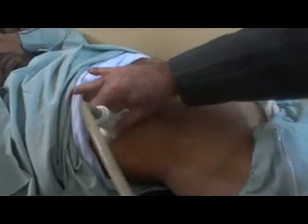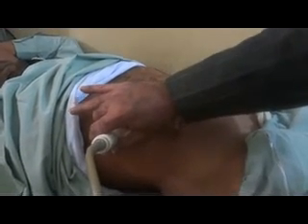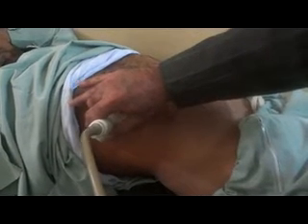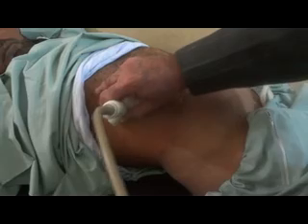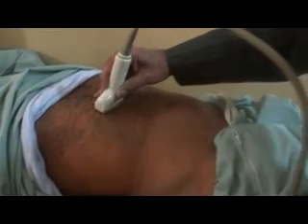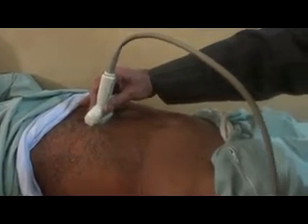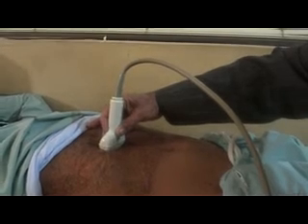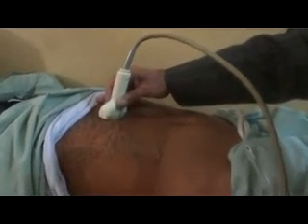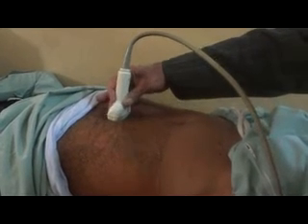To note in this video segment is that the portal vein is transformed into these tiny cystic areas and longitudinal tubular vessels. A normal portal vein will look like this — it will go straight, you won't see this. These are not clots, and this is not portal vein thrombosis — this is the cavernous transformation of the portal vein.